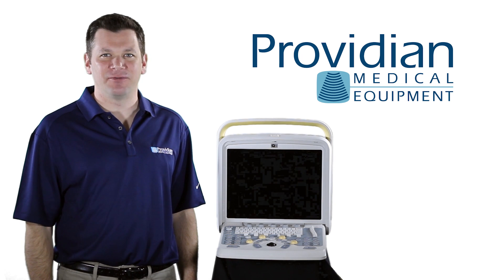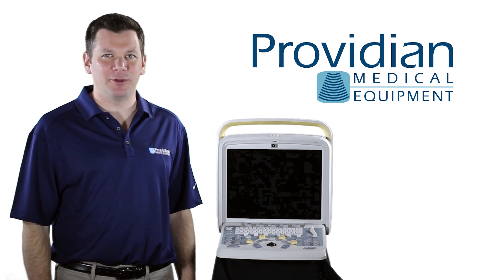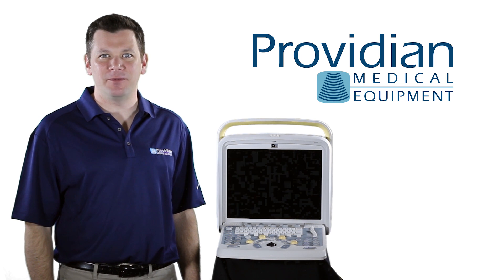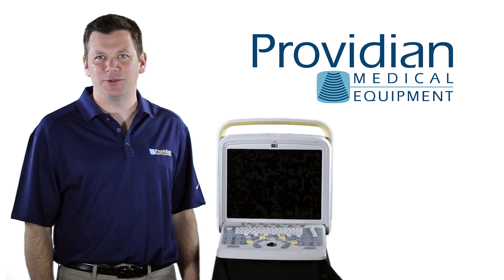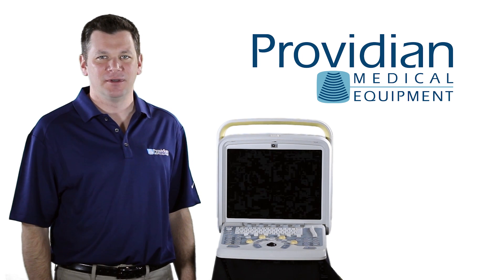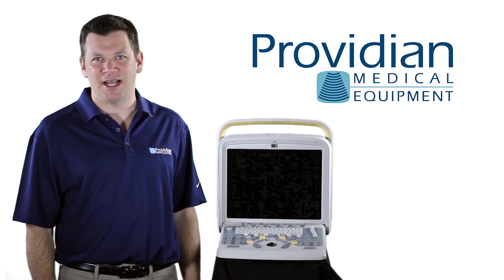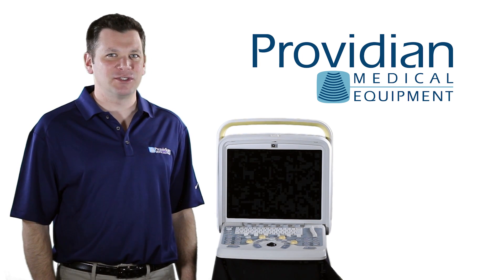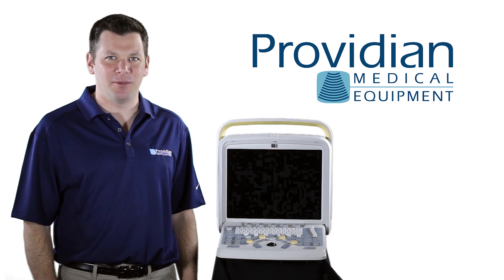The Chison Q5 is a versatile, fairly complete portable ultrasound machine. It can connect to a variety of devices and it's one of the easier machines to use when compared to other low to mid portable ultrasound price range systems. Considering this is designed for smaller offices and hospitals and will be often used by a physician, the Q5 does a nice job of addressing its target market.